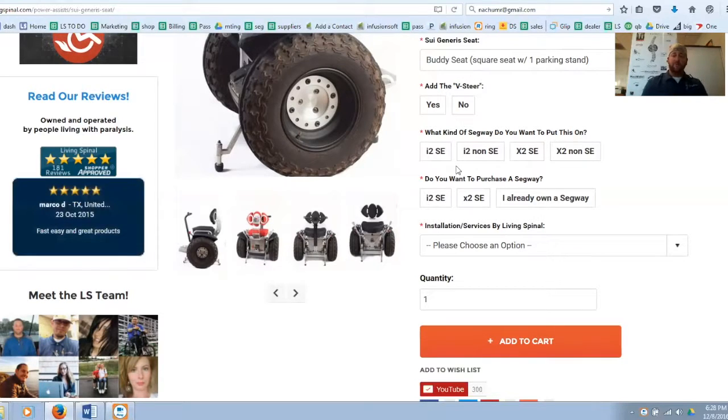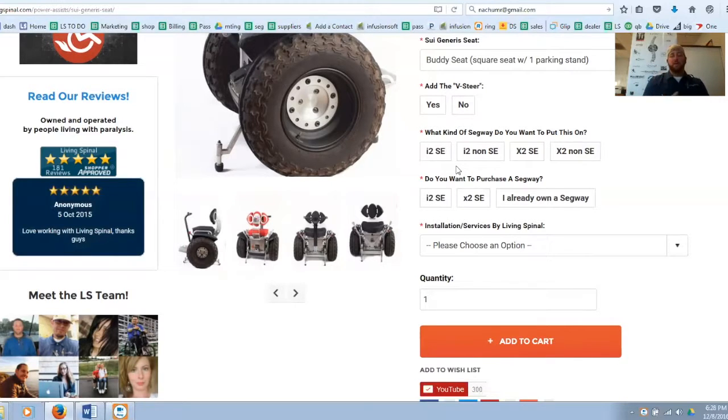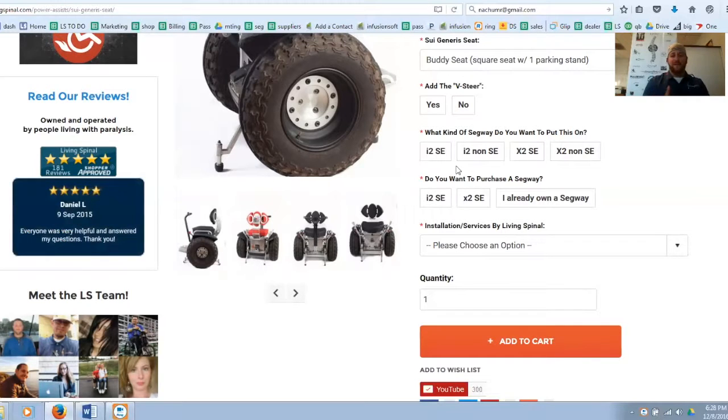How do you tell the difference? Well, the mounting plate for the seated Segway steering arm is going to have 5 hole placements in an SE model, the newer model. The older models actually had a kind of round hub that slides onto that area in between the tires.